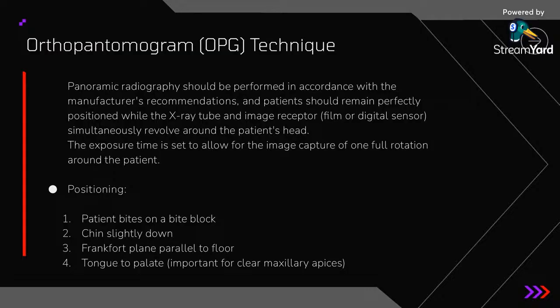Okay, orthopantomogram or panoramic technique. Panoramic radiography should be performed in accordance with the manufacturer's recommendation. This is a very huge emphasis, and it's not just about the OPG that I'm talking about. You should always read the manufacturer's recommendation, even when you're using different sorts of material. You may be using a composite, but the companies may be different. I highly recommend that you read the manufacturer recommendation. The long paper that you get, you should definitely and absolutely read it as a qualified and educated dentist.